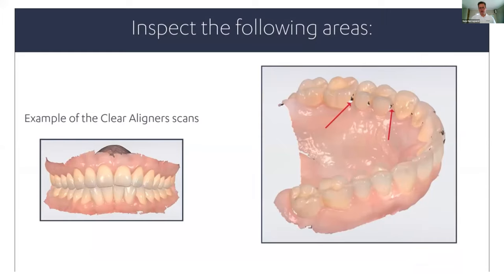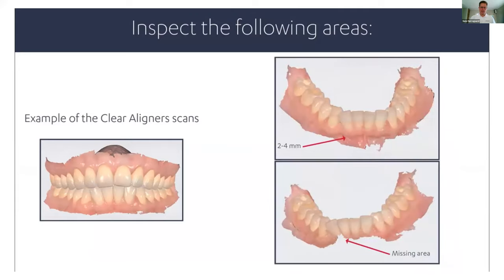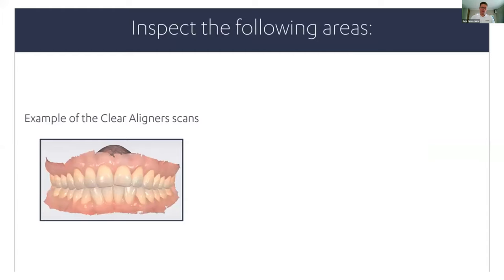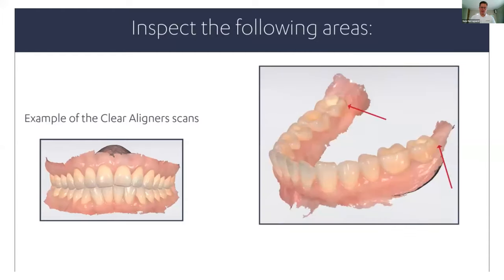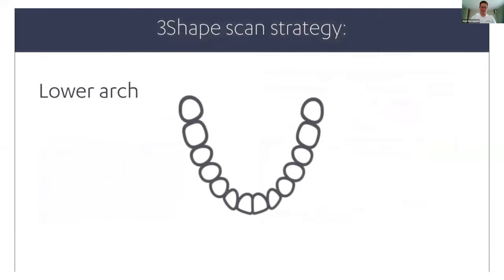So here's an example of an aligner case, and you can see once you stop the scanning, if you notice that there are holes in the scan, you have to go back and stitch those holes together by scanning the surface one more time. If you see double stitching like here, that can also cause problems, especially when the 3D printer receives it. It's important to capture the full mouth, so the more detailed, the better, especially in the back of the big molars, the 7 and the 8.